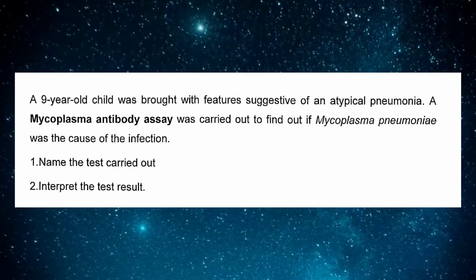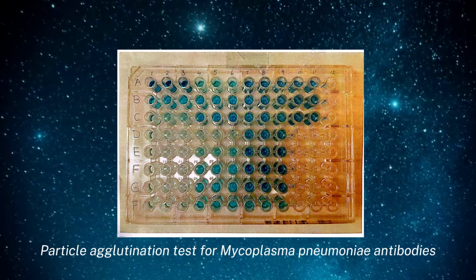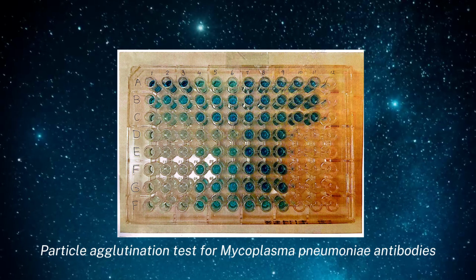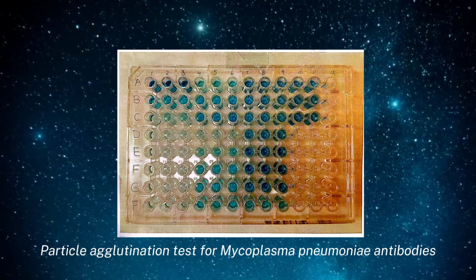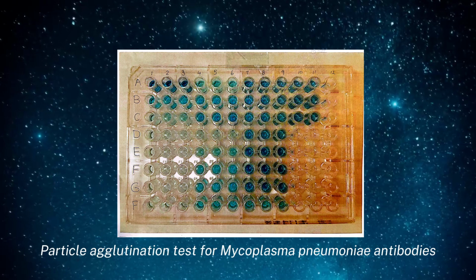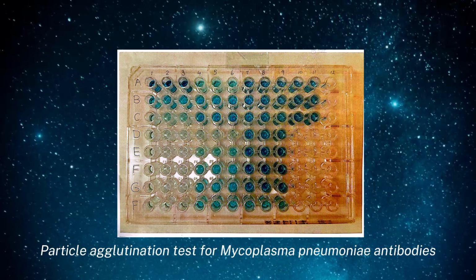Name the test carried out. The test shown is a particle agglutination assay for Mycoplasma pneumoniae antibodies. In this test, particles coated with Mycoplasma pneumoniae antigen are mixed with serially diluted patient serum. If specific antibodies are present, they react with the antigen-coated particles and produce agglutination.